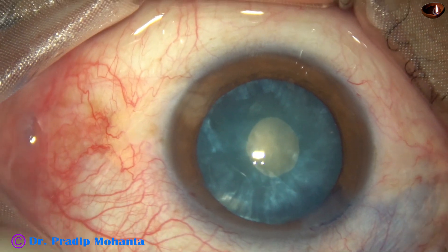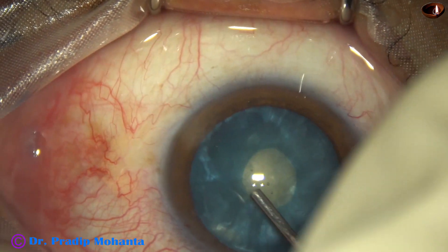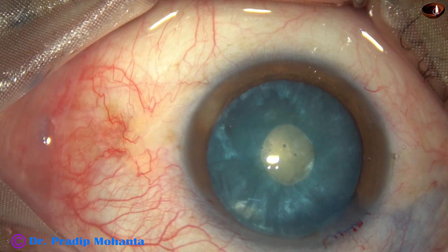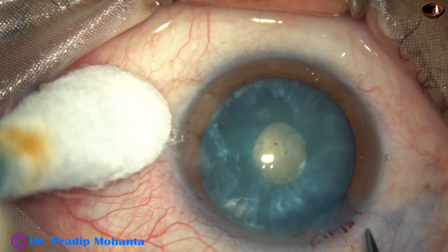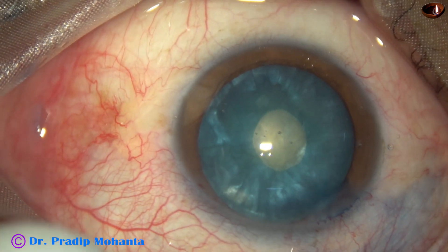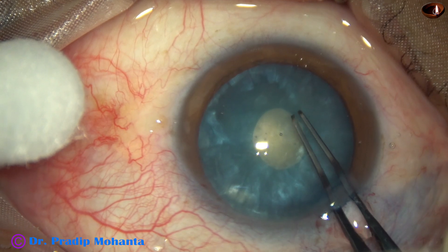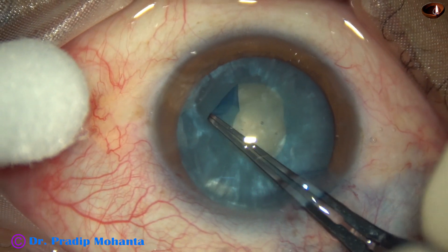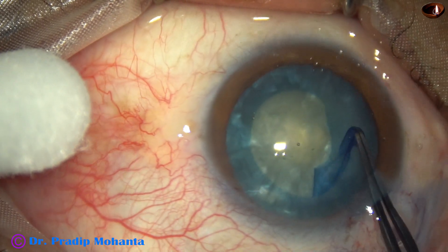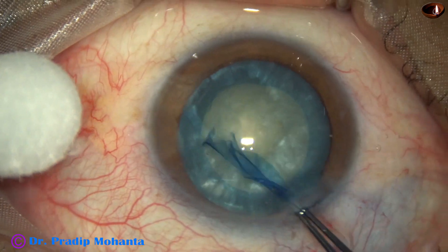Just like a routine case, the capsule will not tend to run to the periphery as we extend this small rexis. When a scissor is taken, a small nick is made at the margin of the minirexis at 8 o'clock. Utrata forceps is taken, and this small rexis is converted into an adequately sized rexis of about 5 mm.